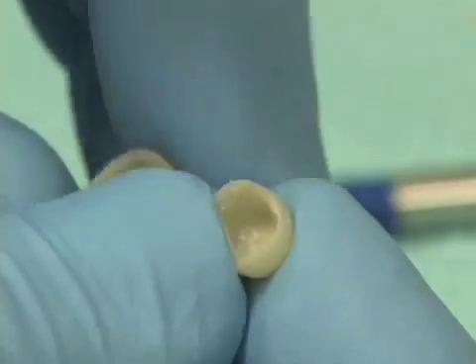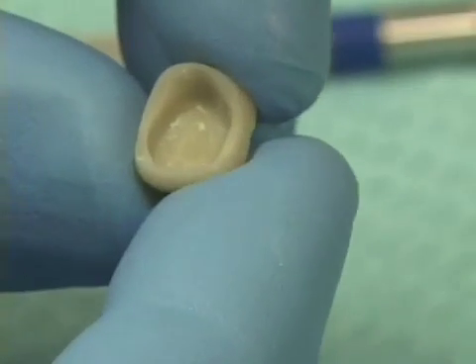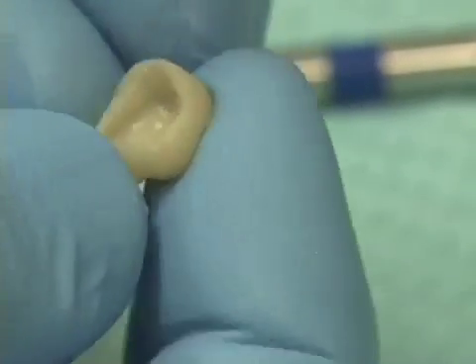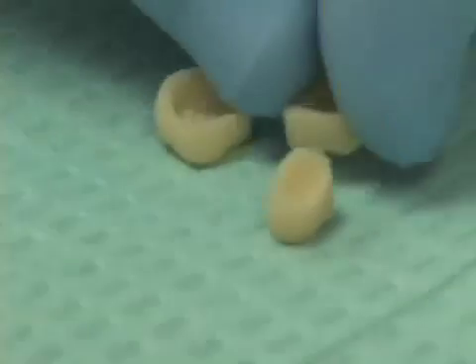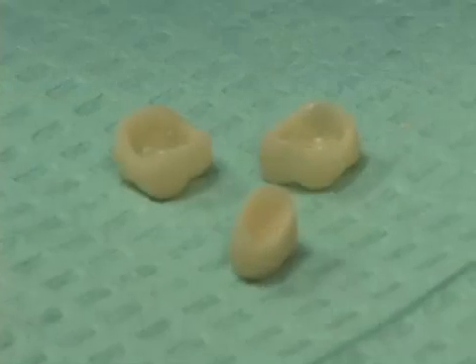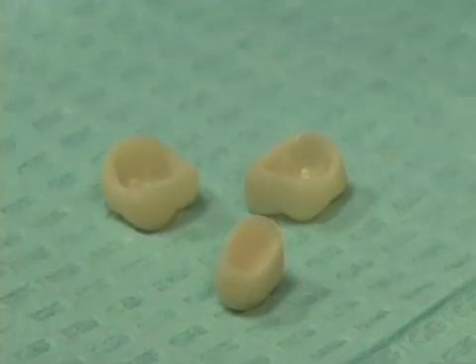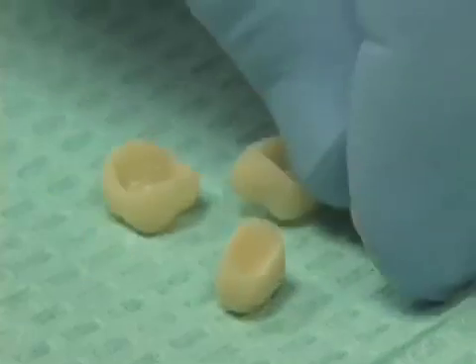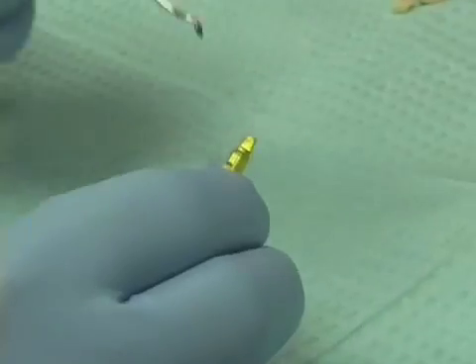The same thing was done to the molars: poured the plastic into the aluminum shell crown form, removed the crown form, contoured the cervical of the tooth, and then proceeded to hollow it out. So what I now have in preparation for seeing my patient are these hollowed-out teeth, fabricated by pouring acrylic into aluminum shell crown forms, peeling the aluminum shell crown form away, and then hollowing out the plastic on the inner aspect.